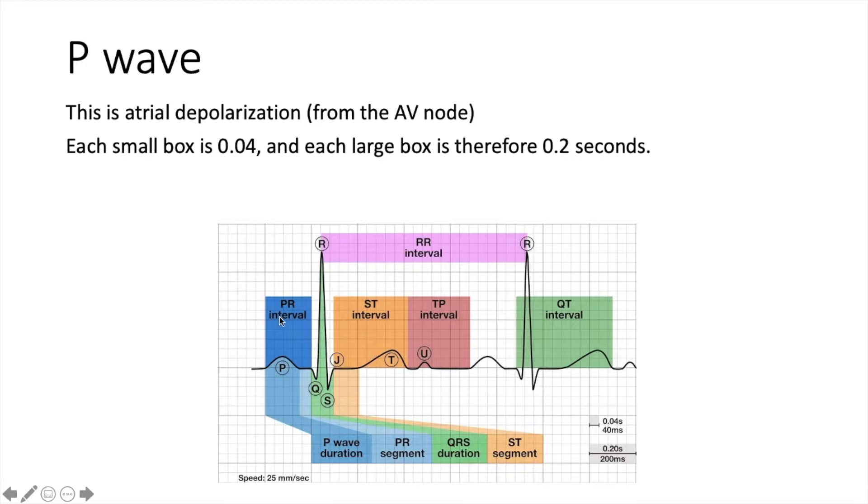So the P wave as I mentioned previously is the atrial depolarisation. One thing that's important to know about ECGs is how many seconds it counts towards. The most important thing to know is that each small box is 0.04 seconds making each large box 0.2 seconds. You have five small boxes in a large box and this is important because it tells you if the PR interval, for example, is too big or too small. For now, it's important just to know this is what a normal P wave looks like.